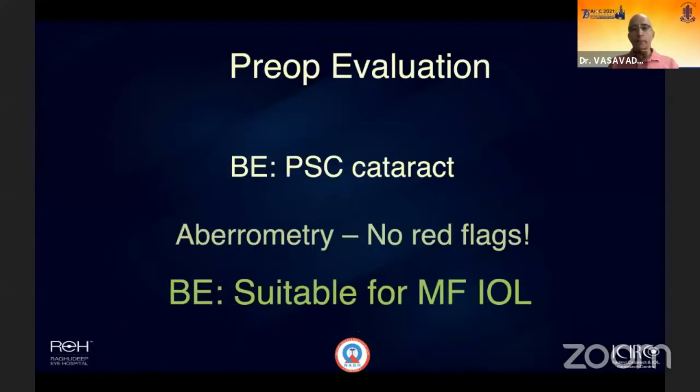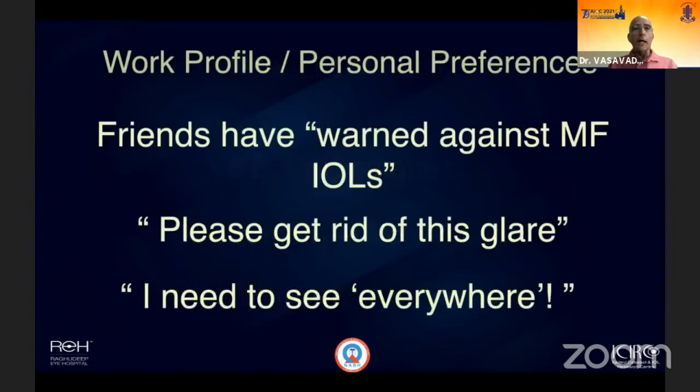And luckily for him, there were no red flags contraindicating multifocal because of optical difficulties, and he was suitable for a multifocal lens. Now, being young, we went one eye first, and we wanted to assess how we would do with the other eye. We told him also, and we were ready to change the strategy in case that didn't work, because young people are sometimes unreasonable in their demands, like the post-refractive patients. So we had to keep in mind his work profile and his personal preference.